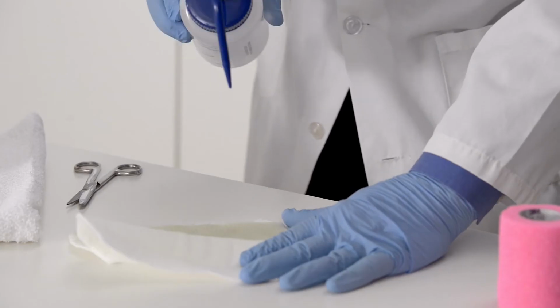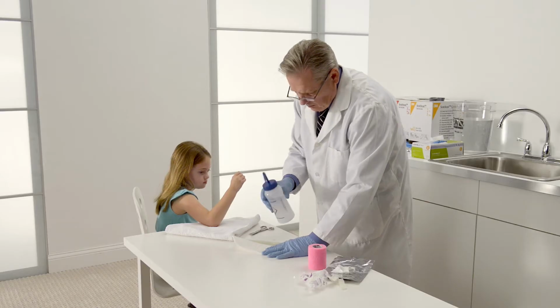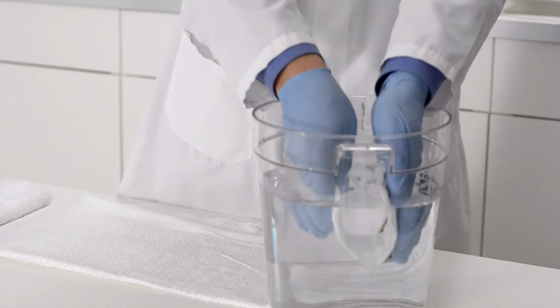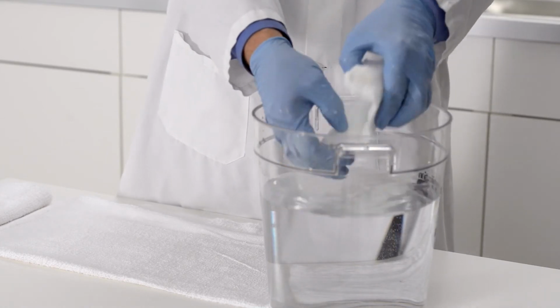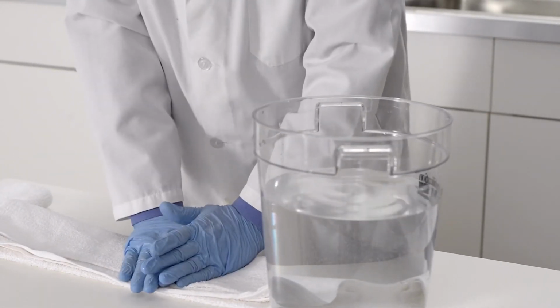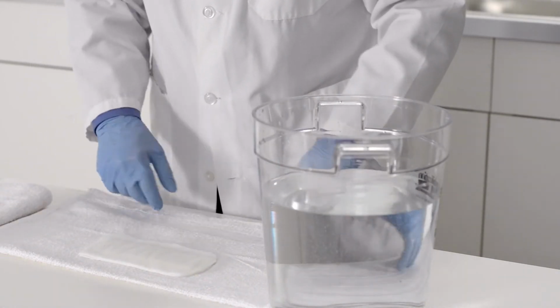The amount of time between activation of the splint material and set time can be customized based on the amount and temperature of the water applied to the material. Or another option to wet the splint: immerse it in a bucket of water and blot off excess water in a towel. Using water that's room temperature provides approximately 3 minutes of molding time. To extend the working time, use cooler water.